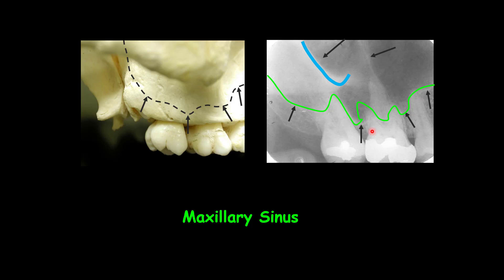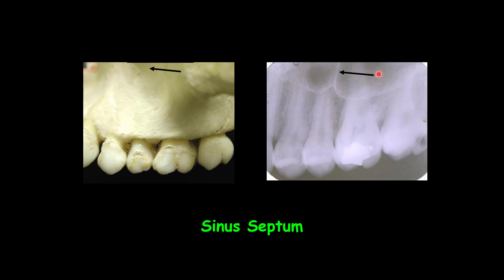You can also see the zygomatic process of the maxillary bone, which we'll discuss shortly, and the sinus septum. Often one or several radiopaque lines are seen in the image of the maxillary sinus. These opaque lines are called septa — thin folds of cortical bone that project a few millimeters from the wall of the sinus. You can see the maxillary sinus floor and the maxillary septa here.